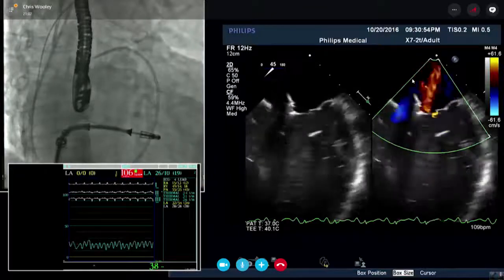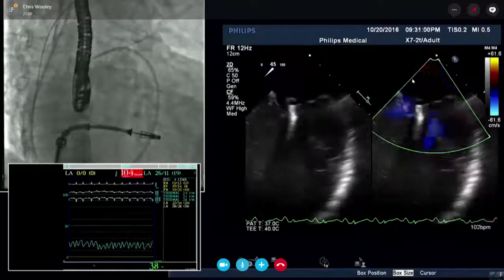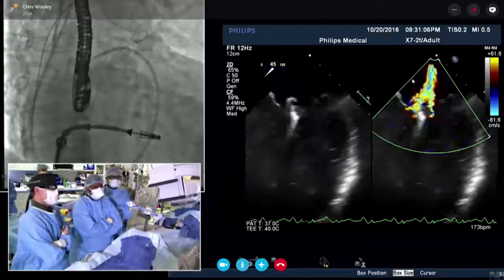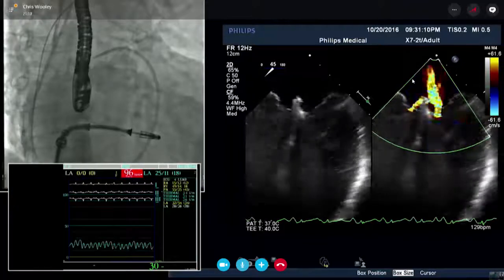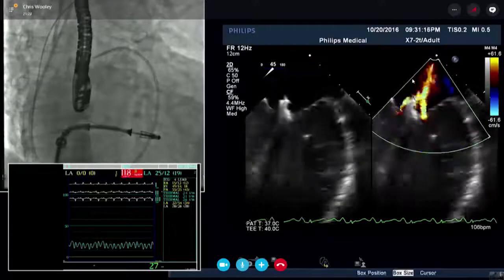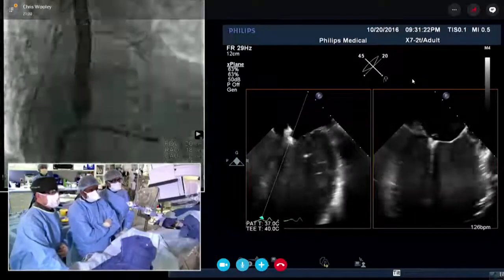And so we have a system now. We're going to check everything systematically. There's a medial jet, there's a lateral jet, but I think we're going to keep this, right? What we're going to do now, have you noticed that the LA pressure came down? Can you hear me there? Yes, we hear you great. Excellent. So, you agree that we should keep this clip? Yes, it looks pretty good. It's actually a pretty good result. It's not perfect yet, but yes. They may want to move it.